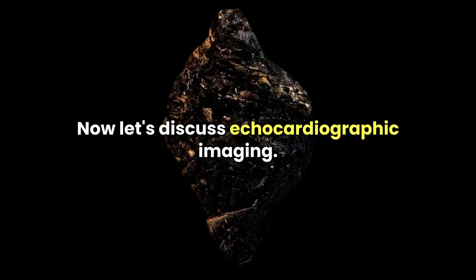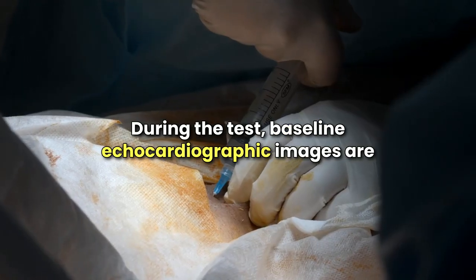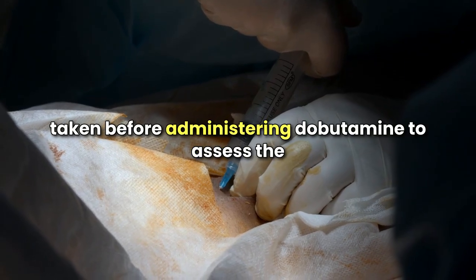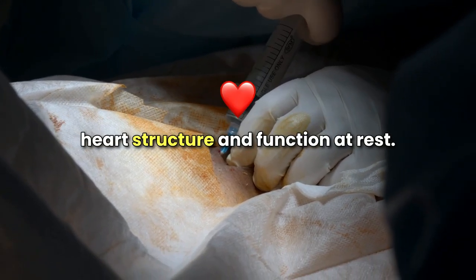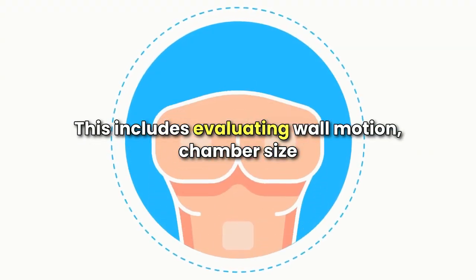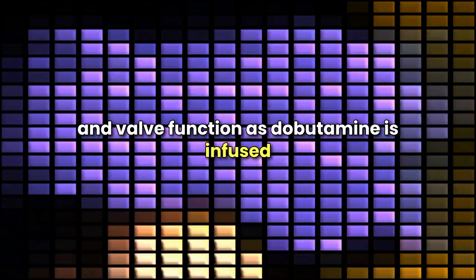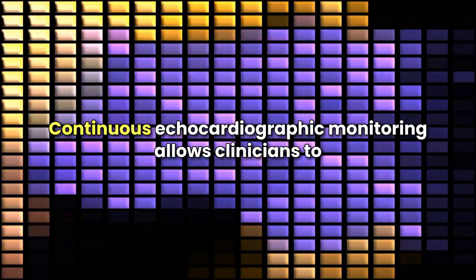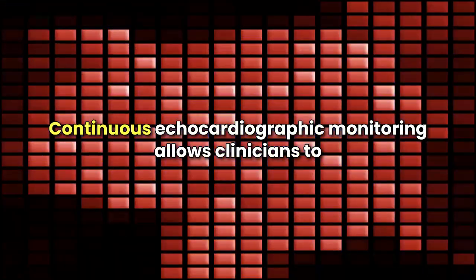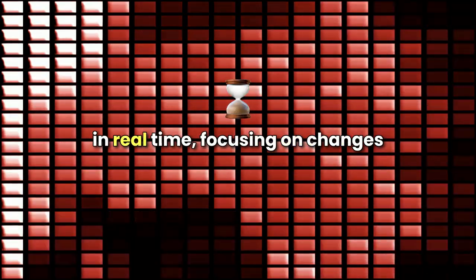Now, let's discuss echocardiographic imaging during the test. Baseline echocardiographic images are taken before administering dobutamine to assess the heart structure and function at rest. This includes evaluating wall motion, chamber size, and valve function. As dobutamine is infused and the heart rate increases, continuous echocardiographic monitoring allows clinicians to observe the heart's response to stress in real time, focusing on changes in wall motion and overall function.